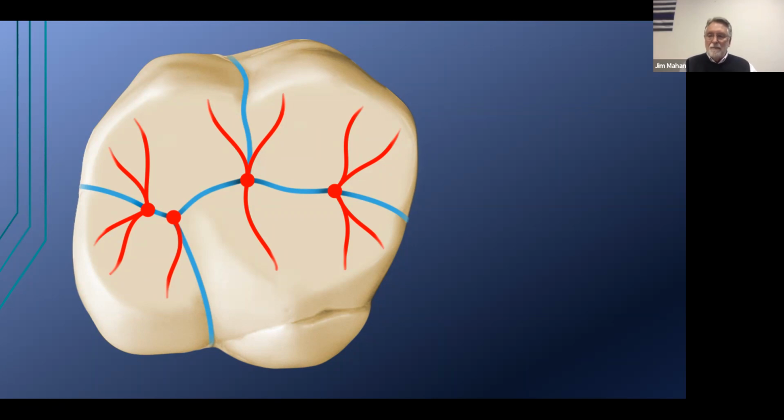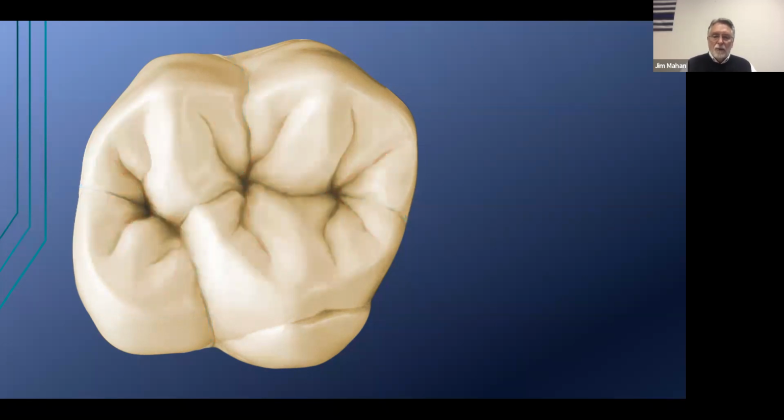That's an unfortunate thing, because sometimes doctors say, I only want Bob to make my teeth. I only want Julie to make mine. And that's not a good thing for a laboratory. That's a laboratory that basically does not have an anatomy standard. And so they're operating on individual technicians doing individual work, pleasing individual doctors, which becomes quite a burden on the laboratory.